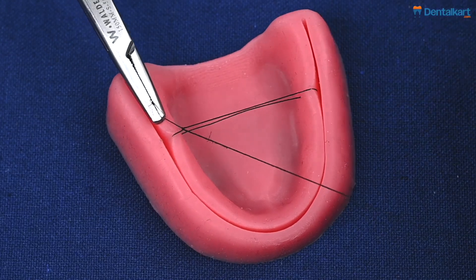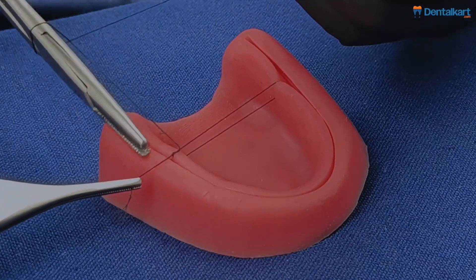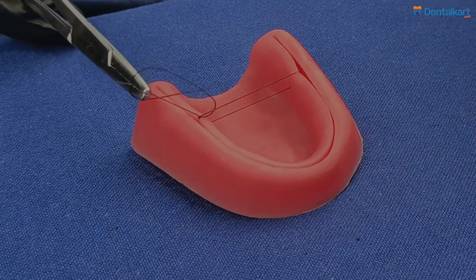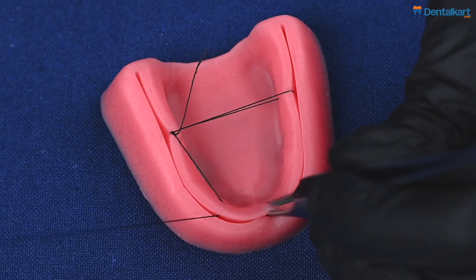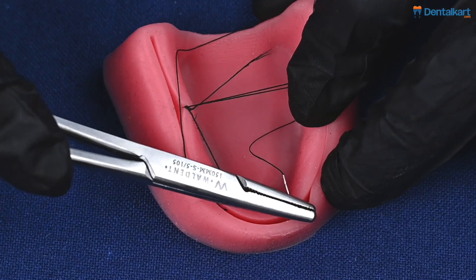We tie the suture in this area. After tying the suture in this area, we take two more bites in the lateral incisor and canine region on either side.